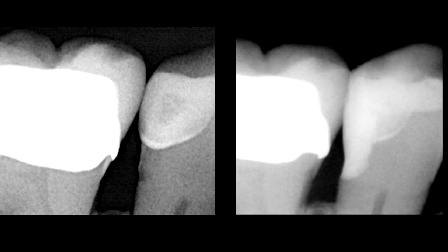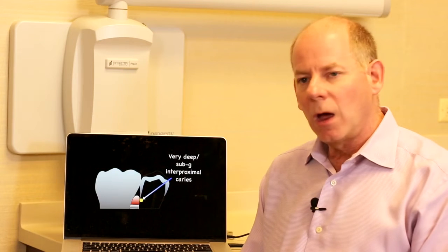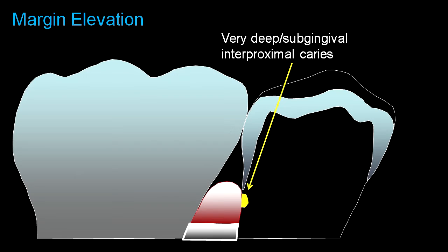Take a look at the caries before we start and then the final restoration. With my illustrations, I'm going to show deep caries — shown here in yellow.